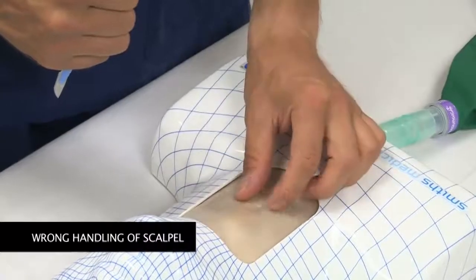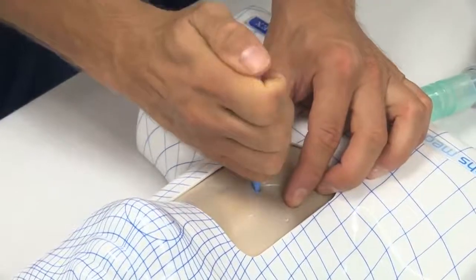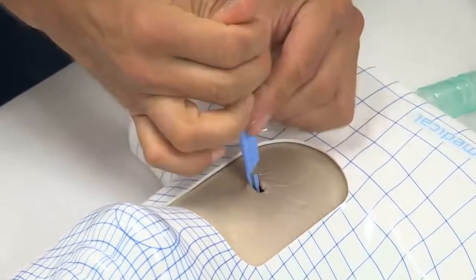Too much force while performing a stab incision may result in excessive damage to the airway. This may cause excessive bleeding or even result in tracheal transection.